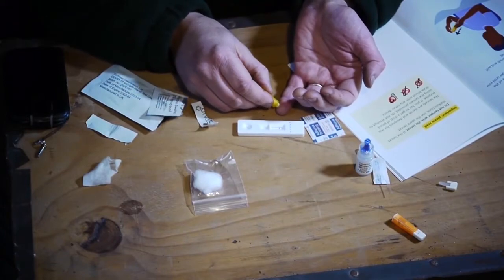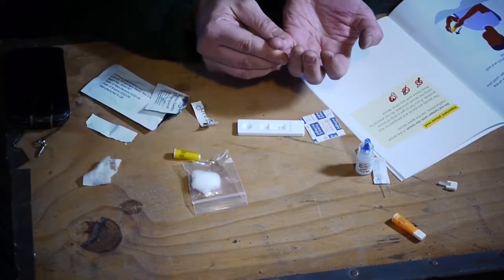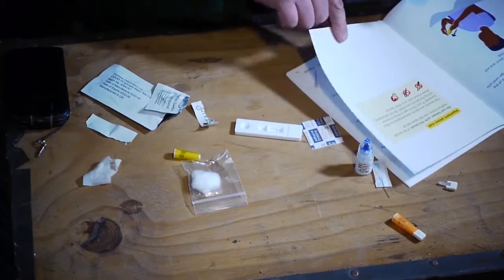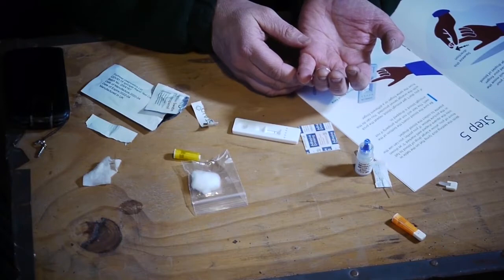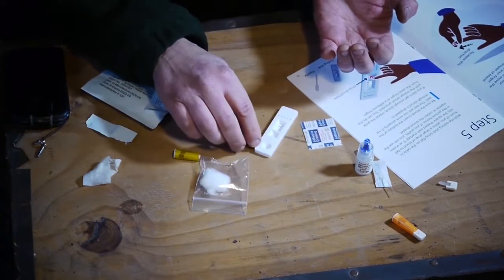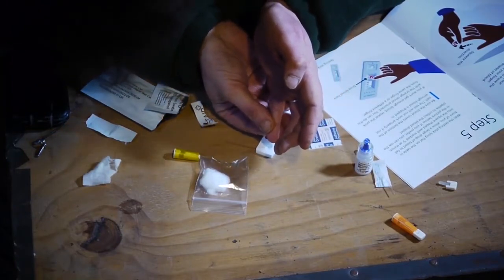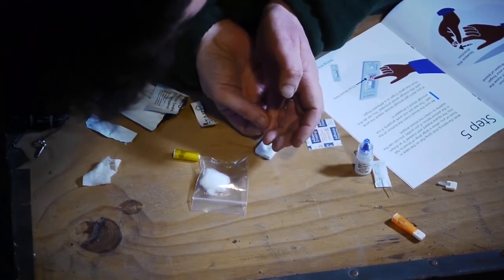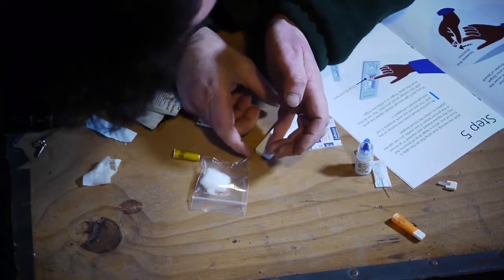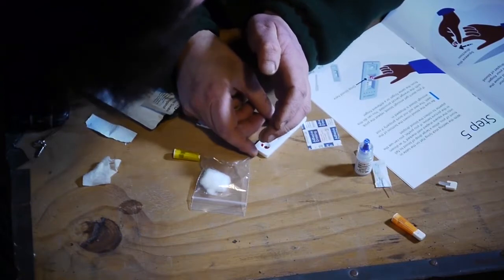Right. That didn't really hurt very much. Oh, there's some blood. Superb. Oh, right. Okay. That actually didn't hurt at all, hardly. I was expecting it to hurt properly. Right, squeeze blood, and I've got to squeeze on this little spot here. Okay, there's the blood. Get out. Can I get enough blood? Get on there, you. Ooh, there's some proper blood.